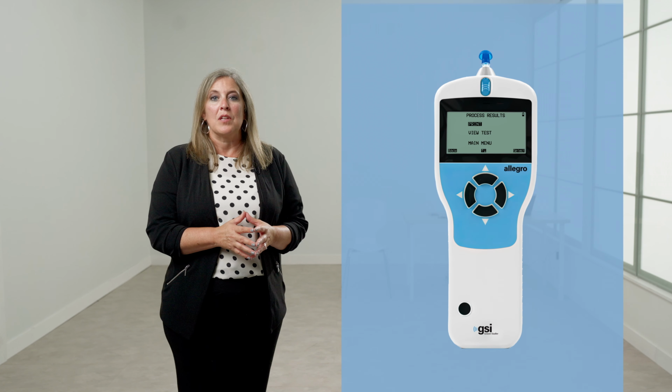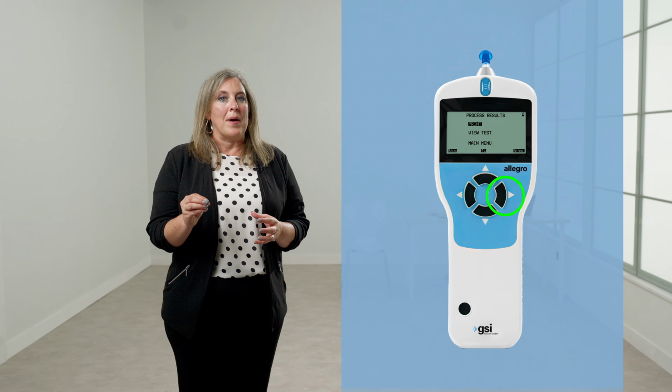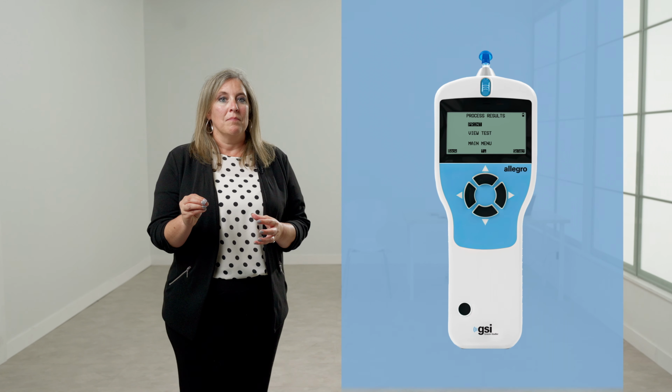To print results of the last test performed, select Send to Printer from the Process Results menu. Press the right button when prompted on the screen. To transfer the data from the Allegro to a computer, the results must be saved to the internal database on the Allegro. The Allegro will hold up to 32 patient records.